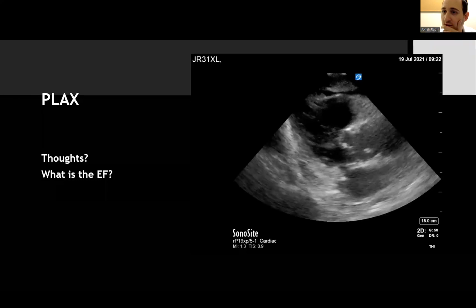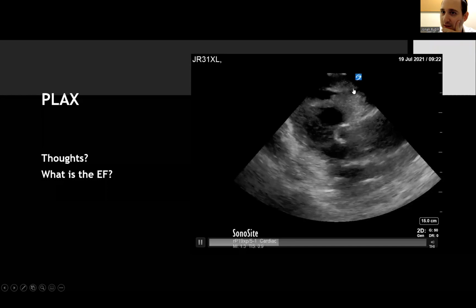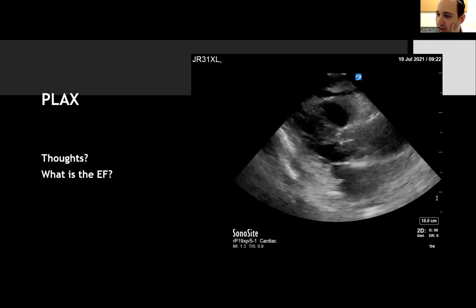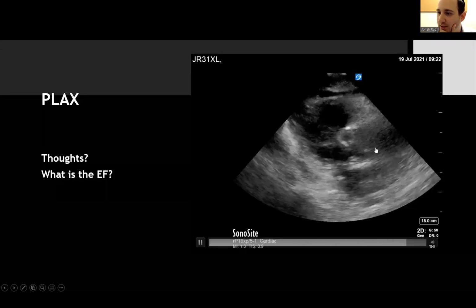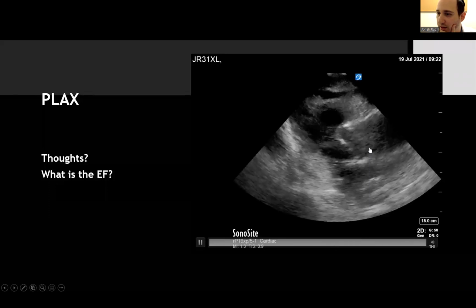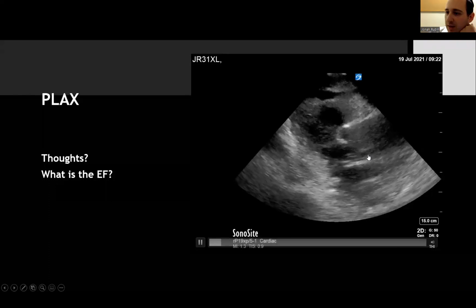Yeah. Helen in the chat is pointing out a pericardial effusion, which people also forget that we can sometimes see in a parasternal long. And we got a comment in the chat from Dr. Rosenberg: off-axis parasternal, but really dilated proximal aorta to sinuses, seems pretty cardiac. A pericardial effusion, need to rule out dissection. I love that. Okay, so Brian, I think you're maybe picking up on this over here. So you're seeing that, if I'm not mistaken, maybe some of this line that can look like an aortic dissection, and this here is probably just part of the bulb. I think part of it, right.